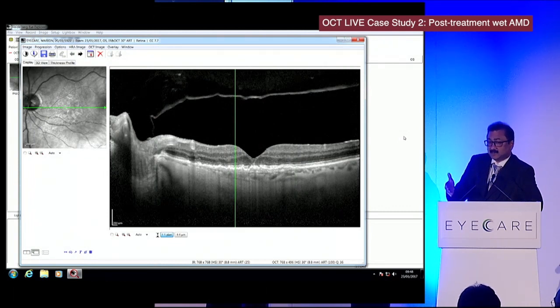You won't see any lifting, any drusen, any bumps on the pigment epithelium. But in age-related macular degeneration, definitely there would be some wear and tear of the RPE. And look at the other eye as well, because usually AMD is in both eyes. If one eye presents with wet changes, there could be some subtle changes in the other eye as well.